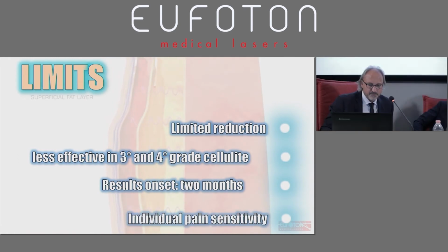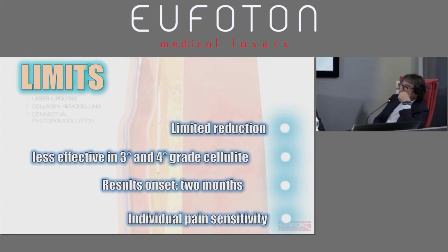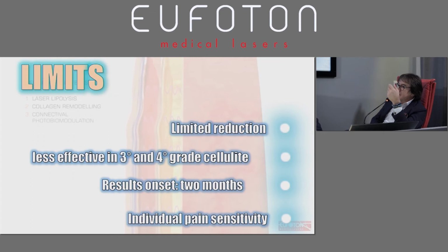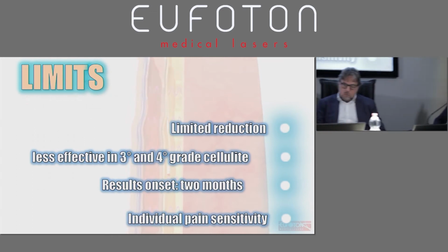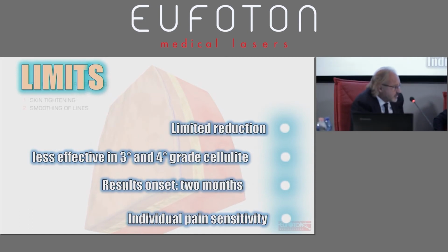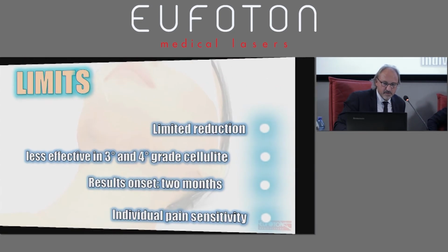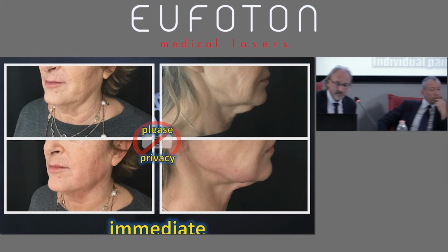I would like to add on some benefits. This therapy can also be done in summertime. Yes, absolutely. The epidermal reaction is a minimum, even though we go beyond the threshold of the yellow traffic light. Absolutely, also in summertime. And also for darker types. No hyperpigmentation also in dark-skinned patients.